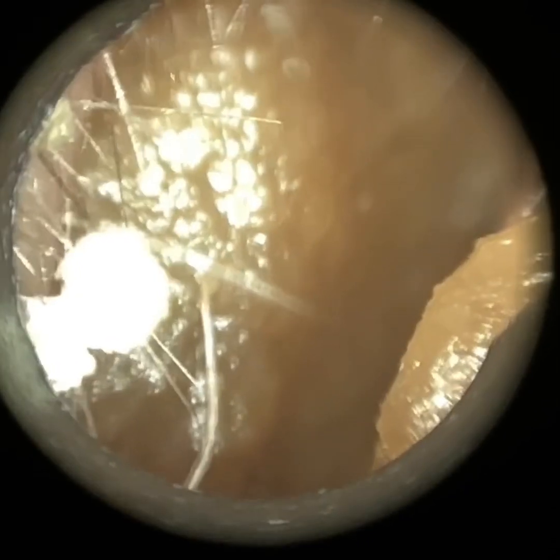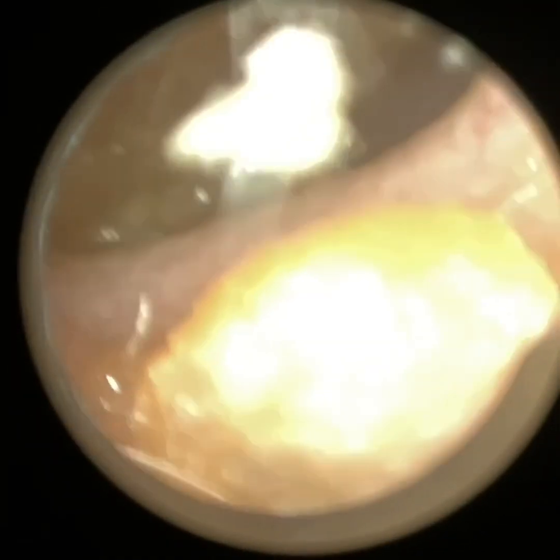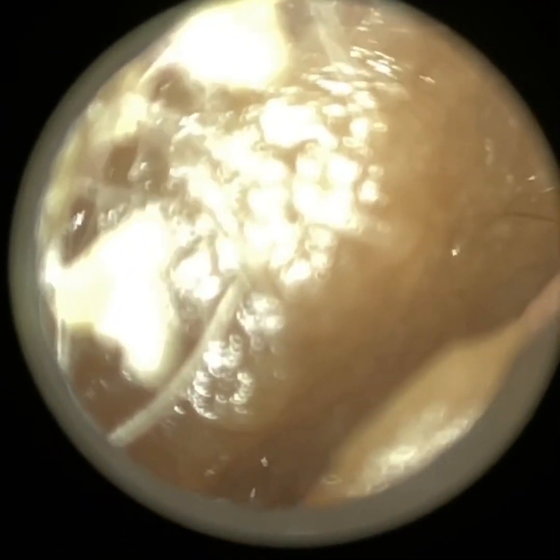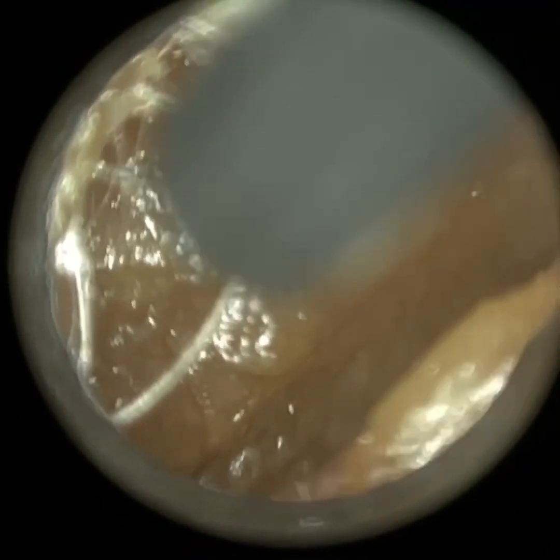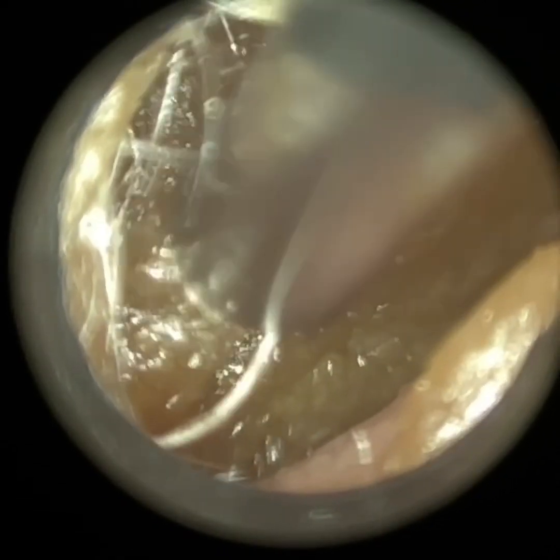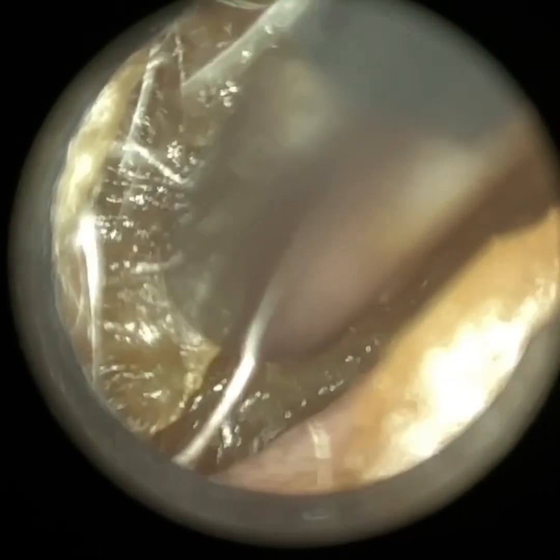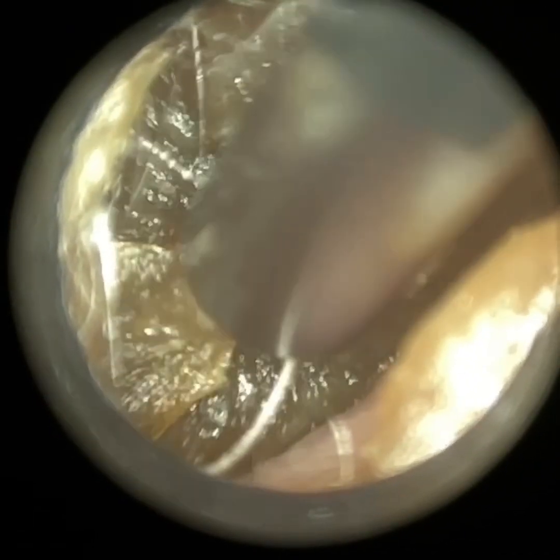Thank you for joining me in my latest video using the Waxcape. Here we have a patient with an extremely prominent anterior canal wall. You will see once I remove this plug of really soft, sticky wax that the front section of the ear canal is extremely prominent. It was so prominent that it was actually obscuring probably half the view of the anterior aspect quadrant of the eardrum.